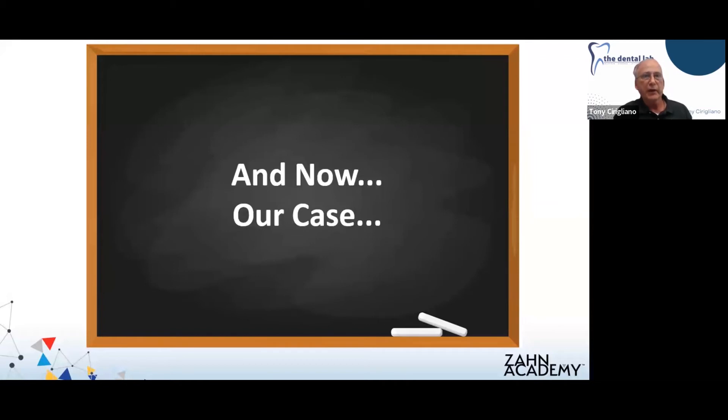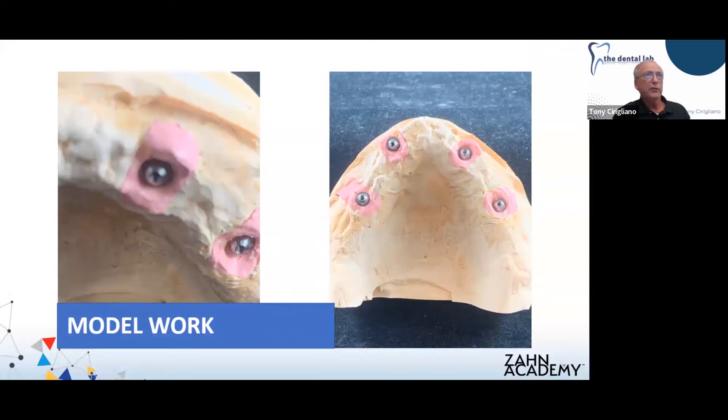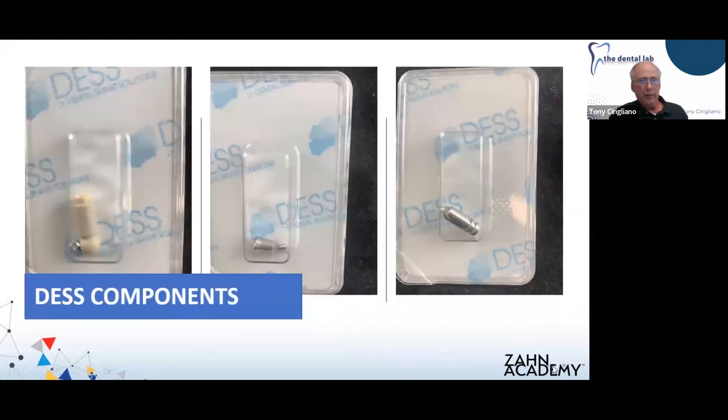Let's get into our case. It was an abutment level impression using DES multi-unit abutments. We poured a soft tissue model. One step I regret not including in this presentation was the fabrication of a verification jig — anytime we do any kind of full-arch or even a smaller zirconia restoration, we like to do a verification jig just to verify that our model is accurate and we won't run into any catastrophic problems later in the process.